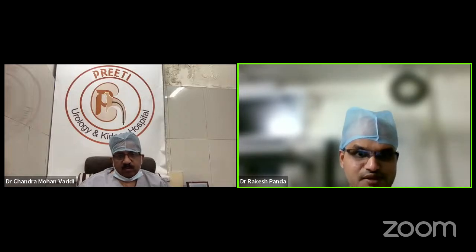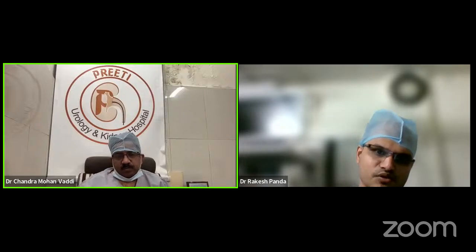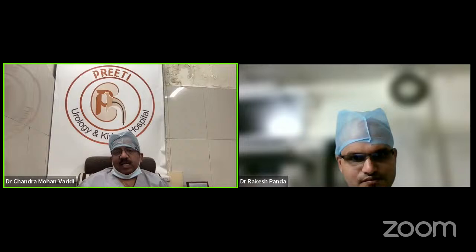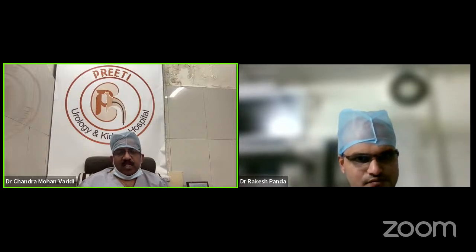We can never reach the superior medial stone, sir. Very difficult. Because we have to puncture in prone position only, direct puncture, and then we can clear the stone. Correct. So medial diverticular stones and medial impacted stones, and low-lying kidneys, supine is very difficult.